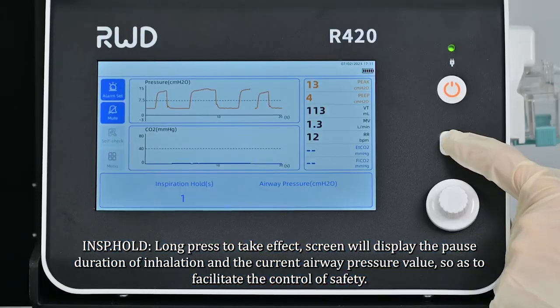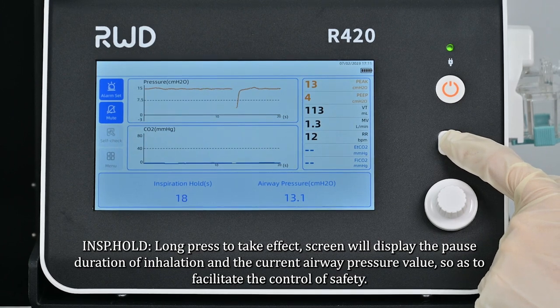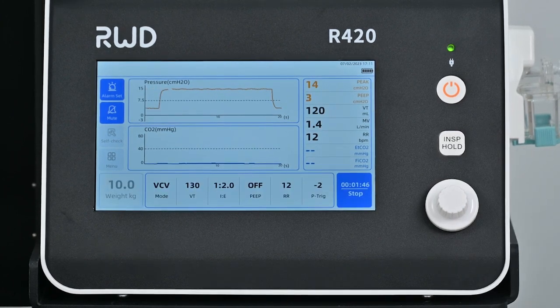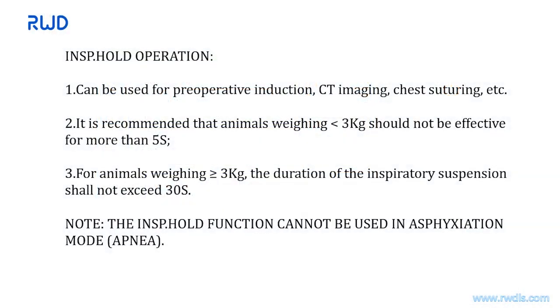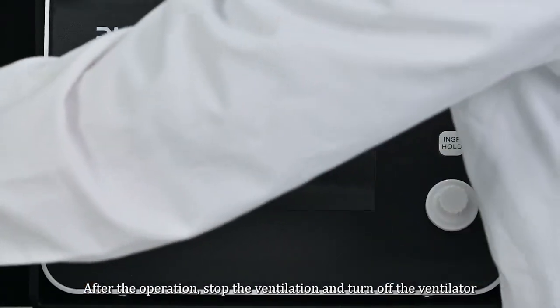For INSP hold, long-press to take effect. The screen will display the pause duration of inhalation and the current airway pressure value to facilitate safety control. INSP hold can be used for preoperative induction, CT imaging, chest suturing, etc. For animals weighing less than 3 kg, the hold duration should not exceed 5 seconds. For animals weighing more than 3 kg, the inspiratory hold duration should not exceed 30 seconds. Note: the INSP hold function cannot be used in apnea mode. After the operation, stop the ventilation and turn off the ventilator.